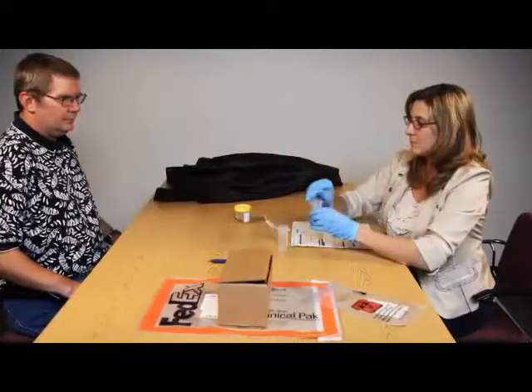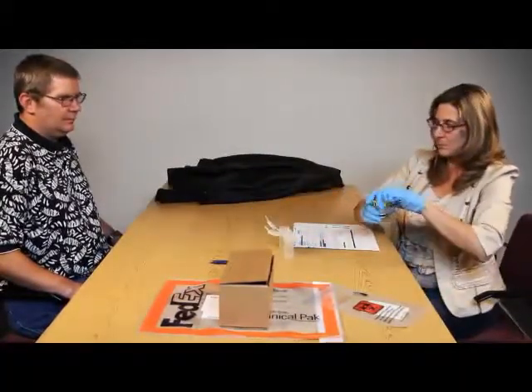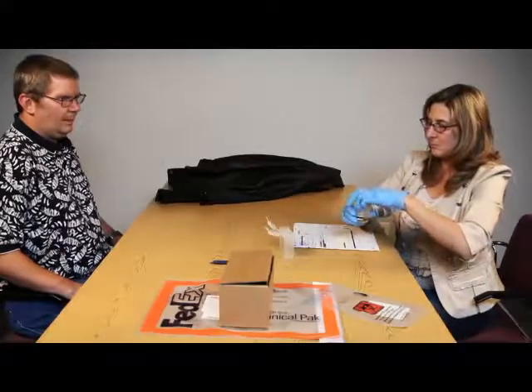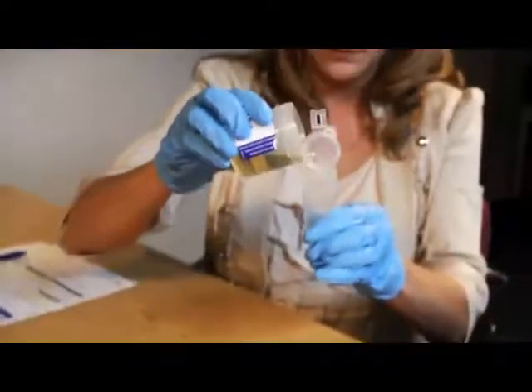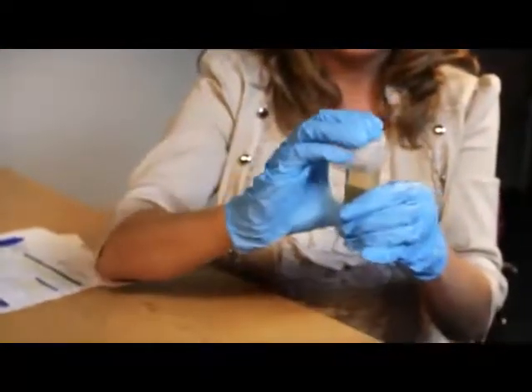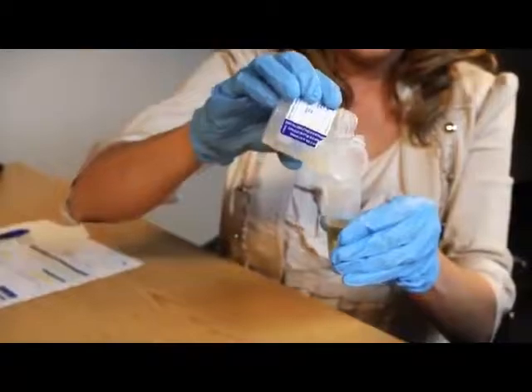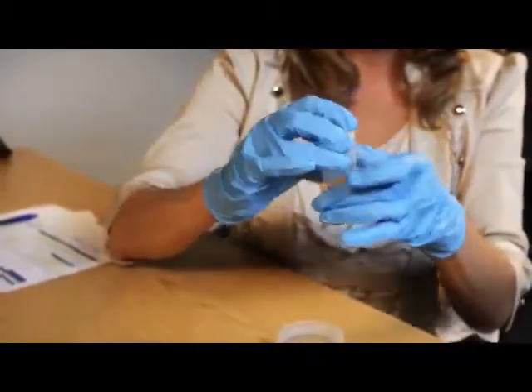Pour at least 30 milliliters of urine from the collection container into a specimen bottle and place the lid, cap on the bottle. This will be the primary specimen or A bottle. Then pour at least 15 milliliters into a second bottle and place the lid cap on the bottle. This will be the B bottle used for the split specimen.